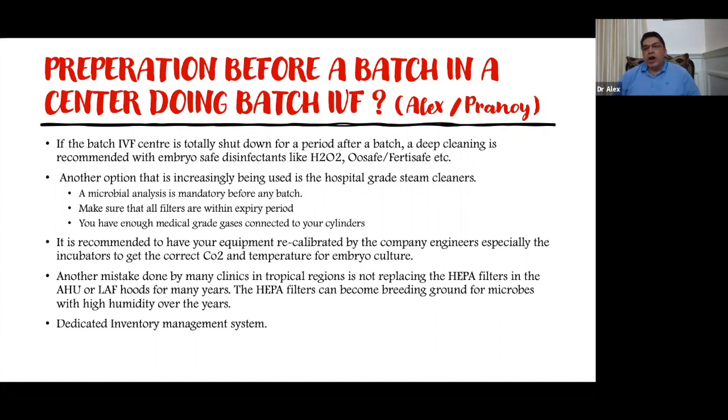And you should also have the engineers who installed things in place so that they can do the proper calibration before you put in the patients, because in a batch you put a lot of patients together, so you have to be very careful.